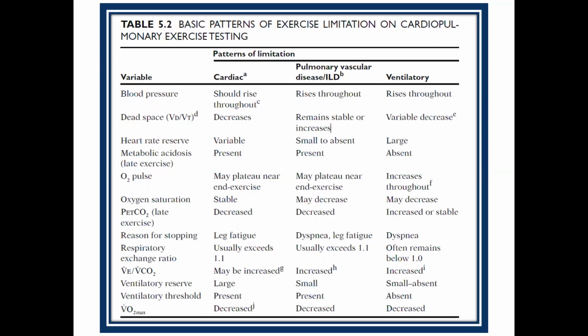So if I missed that, the respiratory exchange ratio, if it's low, does that mean it is not a usable study? Right. If your RER is very low, it's an inadequate effort, but your RER can be low in a patient who gave best effort in a pulmonary limitation circumstance, which I will cover. That is why I'm going to go over these nuances.